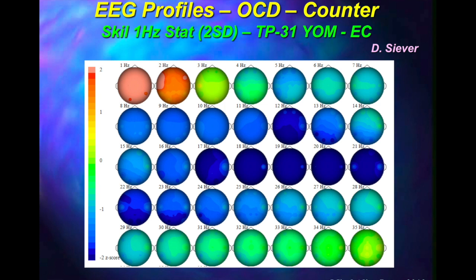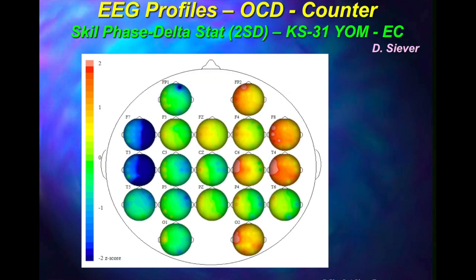Now we see in this case, though, however, we do see a fair bit of a beta dropout. So there could also perhaps be some brain damage going on there as well. Look at the phase problems, left, right. And we have a tendency to see the phase problems be more left, right side. So networks in one direction certainly are very slowed. Again, no history of a head injury.